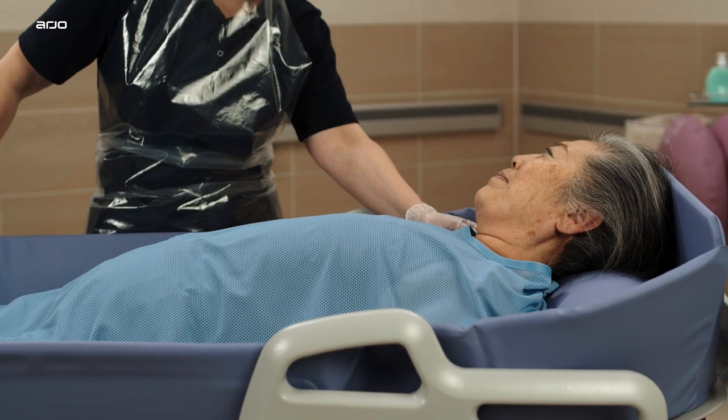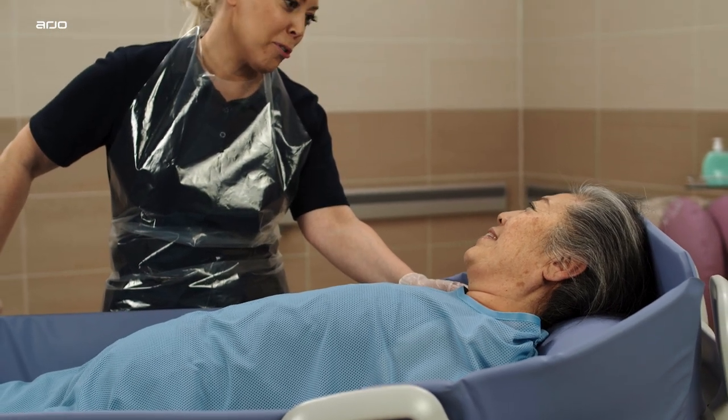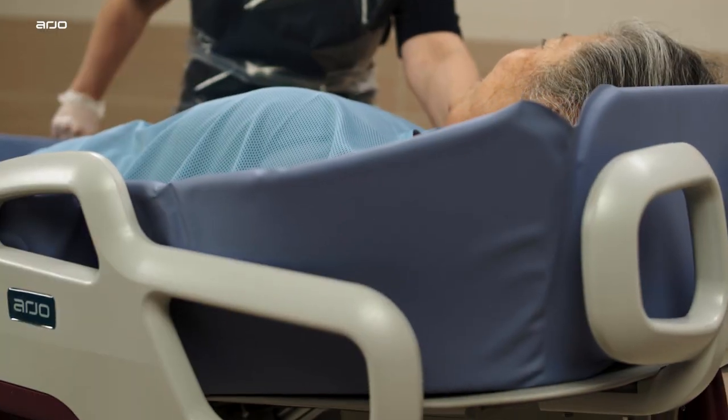Corivo is equipped with an electrically adjustable backrest. Use the control panel to raise or lower the backrest.